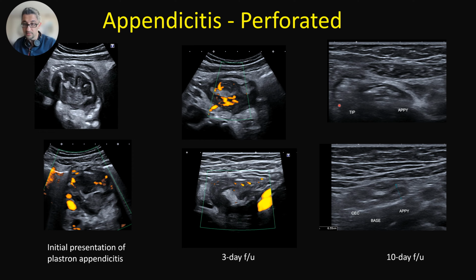And then we started seeing the appendix. Some parts of the appendix had returned to normal size, and the surgeons then performed the appendectomy 12 weeks after this.